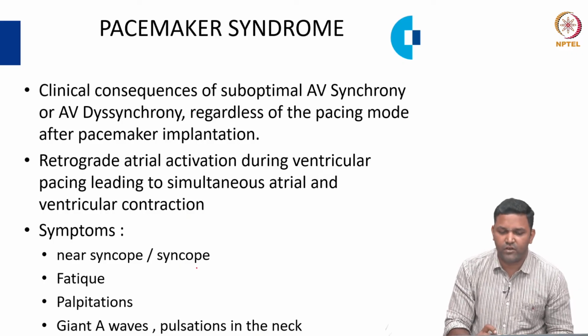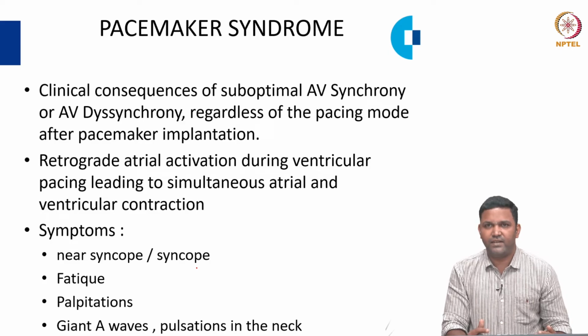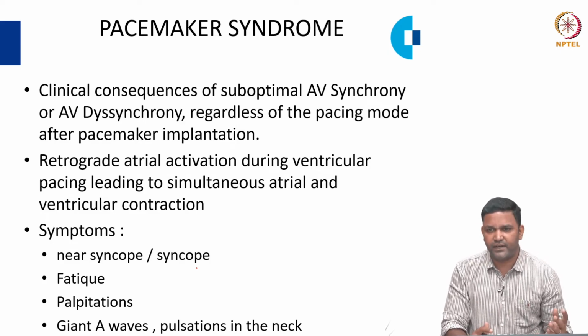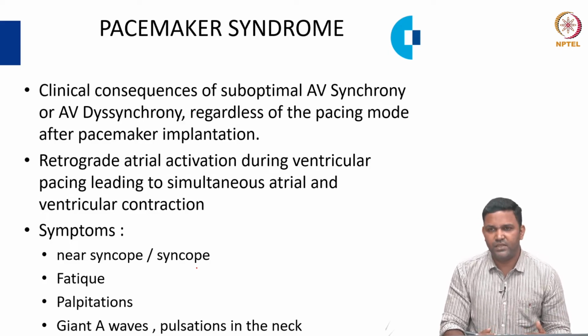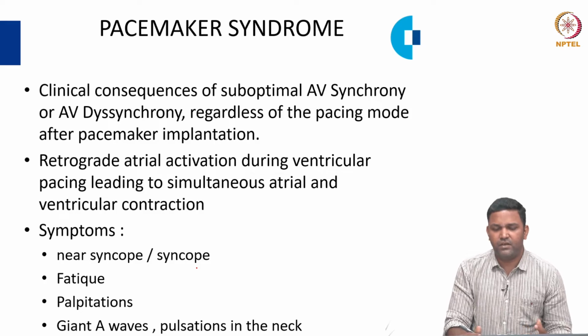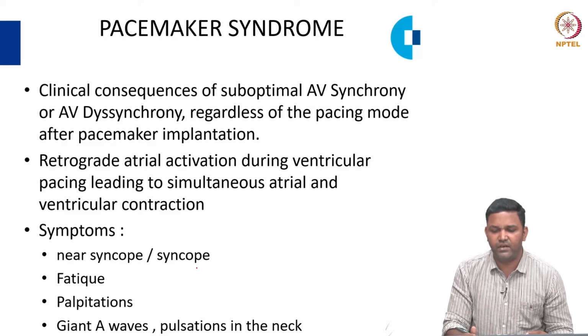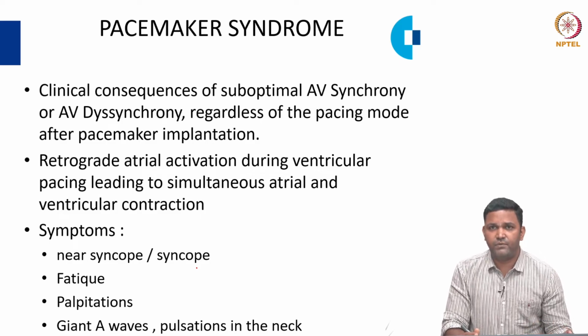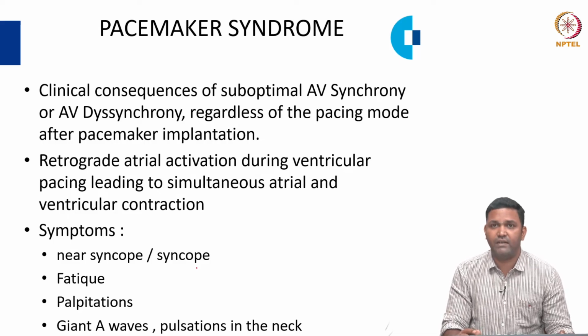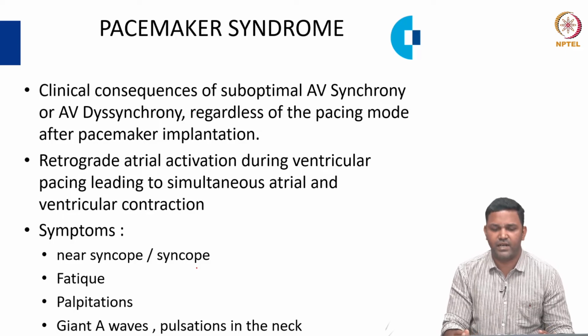So, what is pacemaker syndrome? A pacemaker cannot replace the natural conductive system of the heart. We do our best to attain the maximum physiological effect by using a DDD pacemaker, but if we do not use a DDD pacemaker and go with a VVI pacemaker, we can end up in pacemaker syndrome. It happens because of the clinical consequences of suboptimal AV synchrony or AV dyssynchrony, regardless of the pacemaker mode, after the pacemaker implantation.